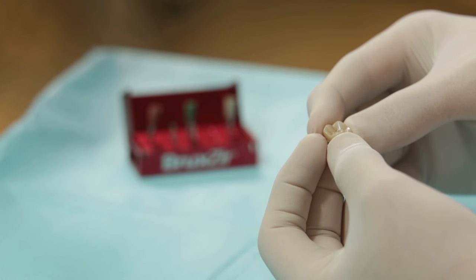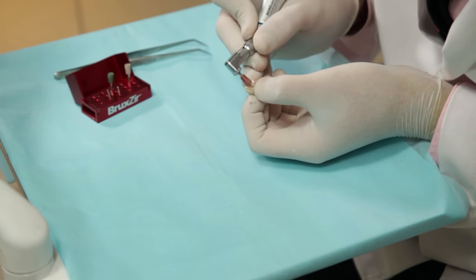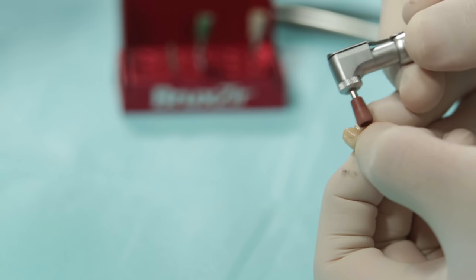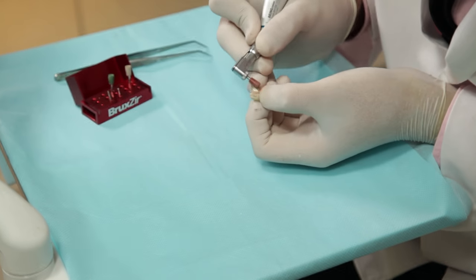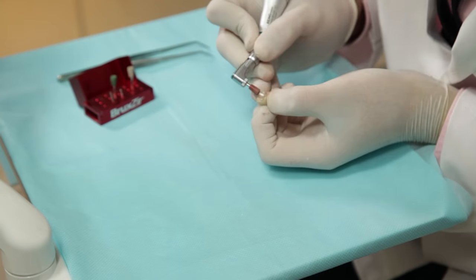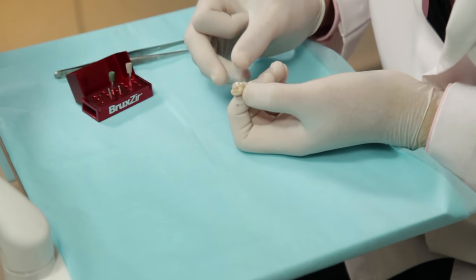It's now time to polish this restoration. The first cup that I will use is the brown one. This will help us pre-polish the surface and reduce the roughness to some extent caused by the bur. So there it is — you can see that already there is a difference.